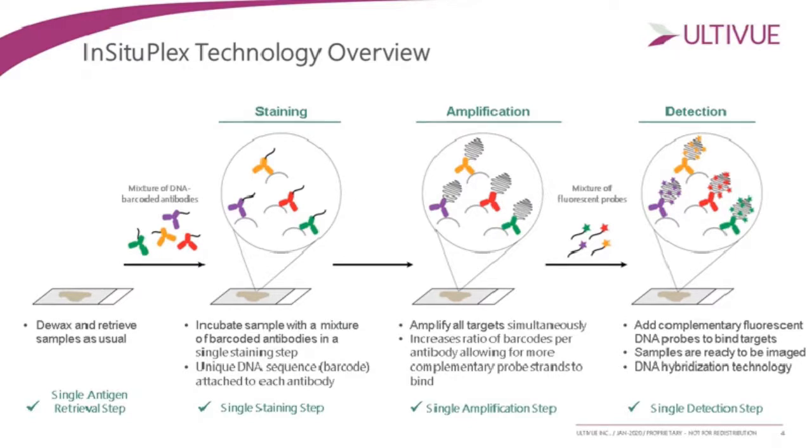Next, we have the amplification step, which happens at the same time and same rate for all the antibodies and allows a broad dynamic range of expression.